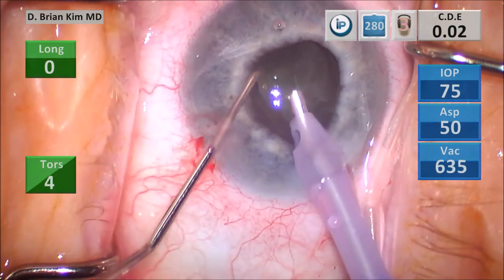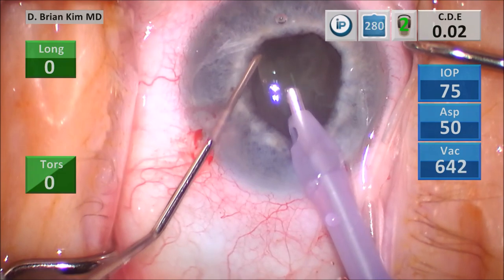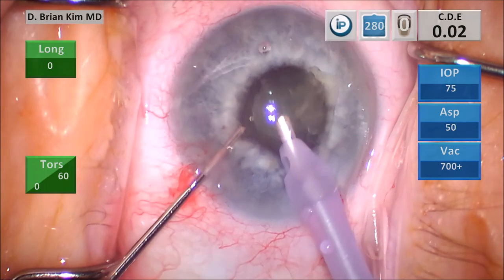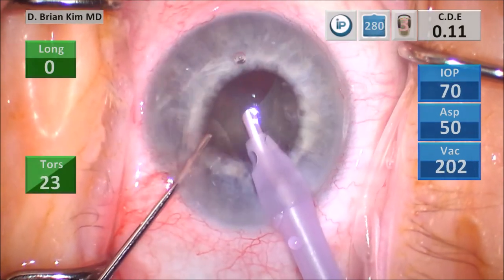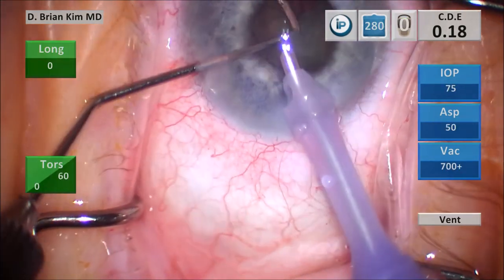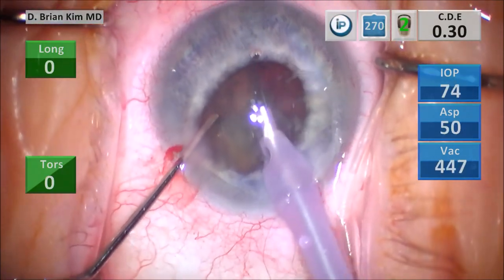You can see I'm going after one quadrant here, and the iris flies into the tip because of the vacuum despite being nowhere near the tip during this maneuver. The benefit of this technique is I don't have to use high ultrasonic energy and risk damaging the iris. I can use vacuum and mechanical fracturing forces with the chopper to control the iris so it doesn't come to the tip, without needing any pupil expansion devices. Since this pupil is extremely unstable, I'm going to turn the suction off. With each chop maneuver in these cases, you turn the vacuum off and then pull the pieces out of the bag mechanically with the chopper — this is much safer than relying on the phaco tip vacuum to pull pieces out.